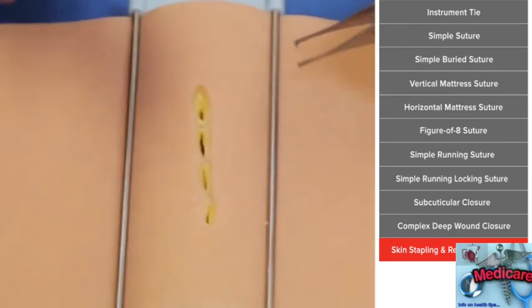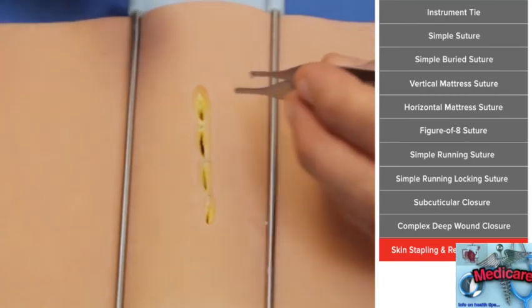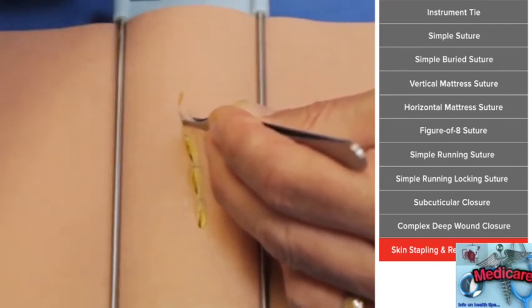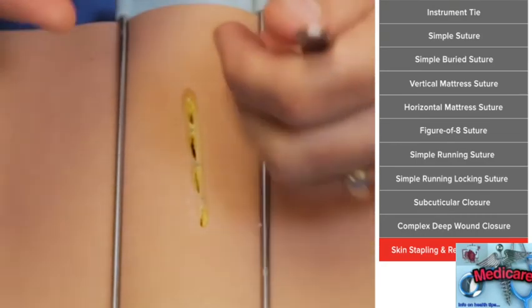It literally will grab the edges and then turn them in, which helps to evert their edges, which again is very helpful. So stapling is nice because it's fast and will turn the edges out. So here I'm approximating the skin, everting it, getting it close together so that the skin edges are touching, and then placing the stapler. And you don't need necessarily to push down very hard.